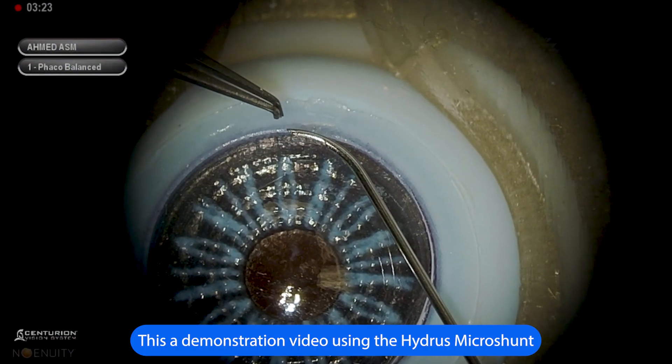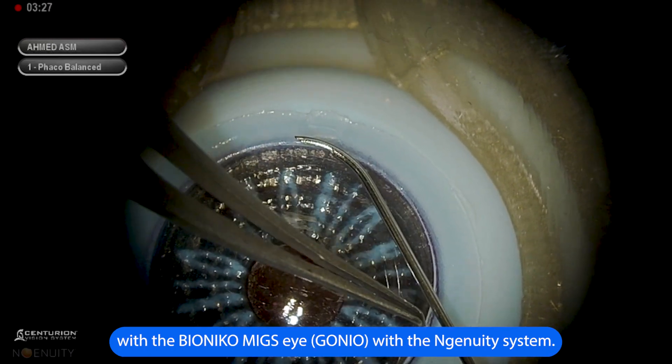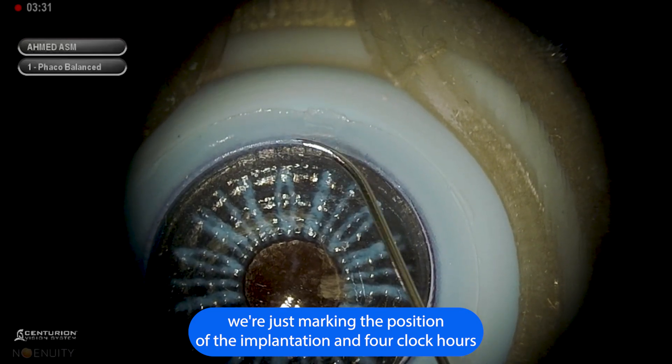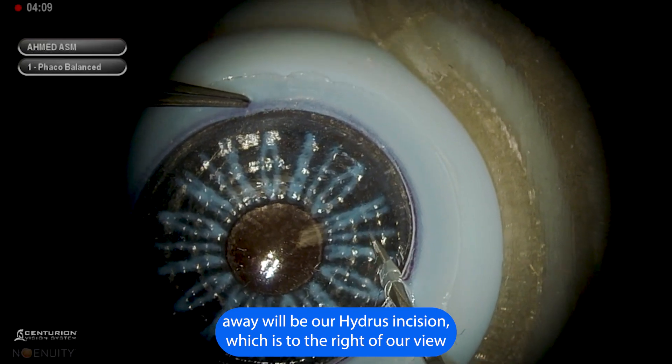This is a demonstration video using the Hydrus Microshunt with the BIONIKO MIGS eye (GONIO) with the NGENUITY system. We're just marking the position of the implantation, and four clock hours away will be our Hydrus incision, which is to the right of our view.